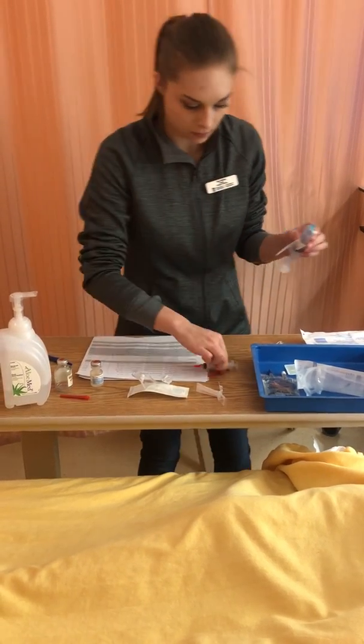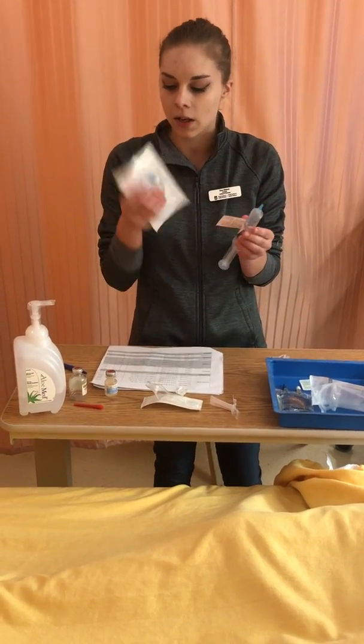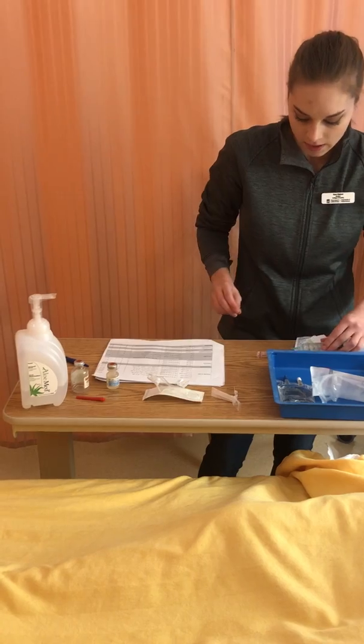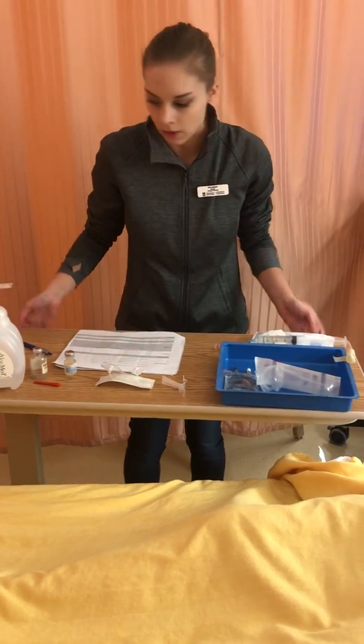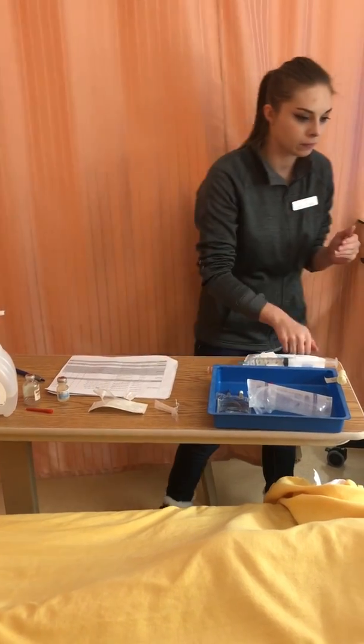Urinary tract infection. So when I'm going to the bedside, I have my medication, I have my microtubing, I have an alcohol swab, and we are ready now to go. I'm going to perform some hand hygiene first.